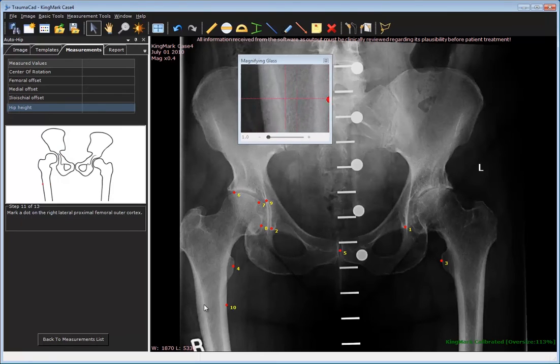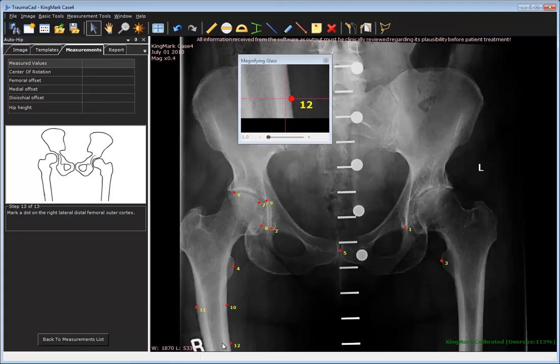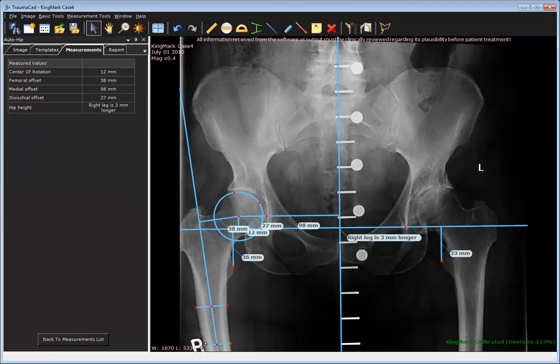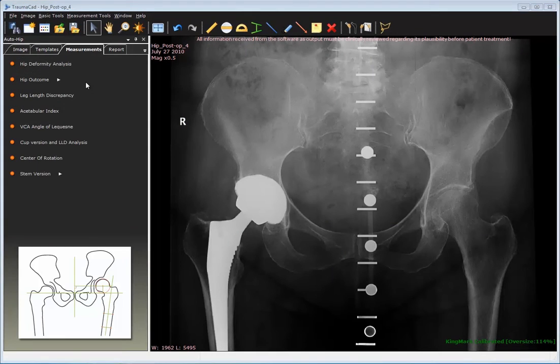Hip height compares the distance between the tip of the left and right lesser trochanter to the reference line. In this image, the software has calculated that the right leg is three millimeters longer.